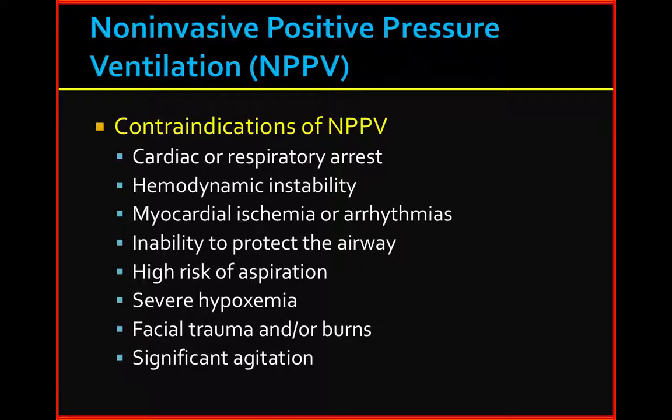Generally speaking, for derangements pertaining to arterial O2, we change the patient's FiO2 or PEEP. Therefore, for this patient with hypoxemia, we will likely start by changing her FiO2. We could additionally change her PEEP.